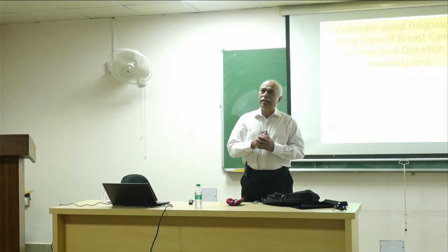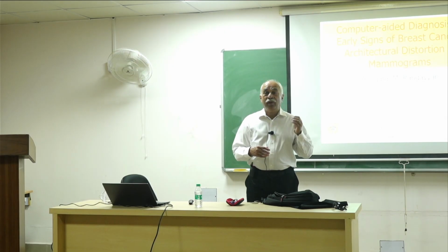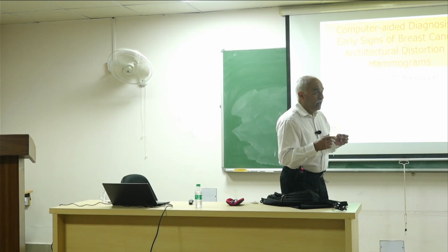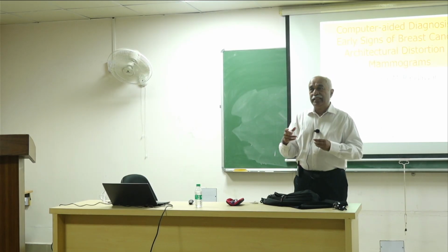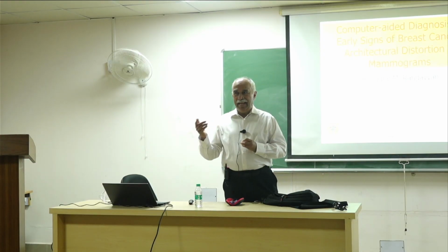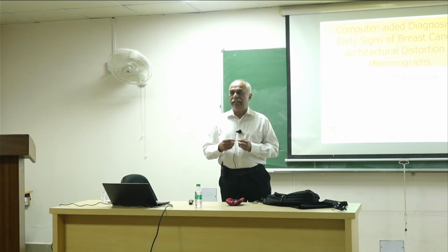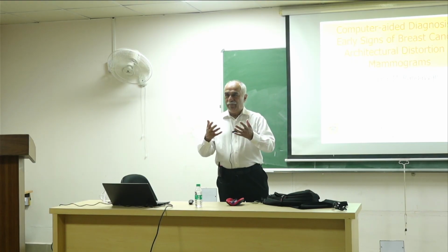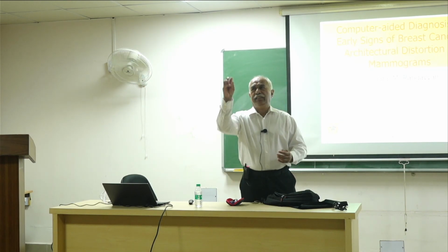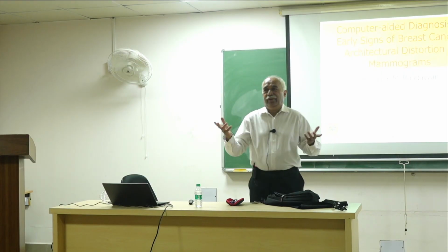And what is emphasized is that a CAD system need not duplicate what a radiologist does. If a CAD system can catch what a radiologist may typically miss and help in catching such difficult to detect cases, then there is some benefit. If the CAD system does the same and shows here is this calcification, the radiologist says, I can see that, I don't need your help.